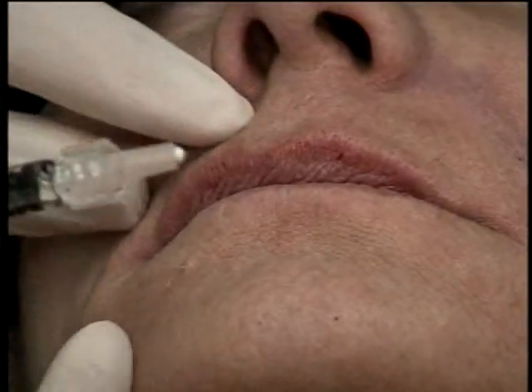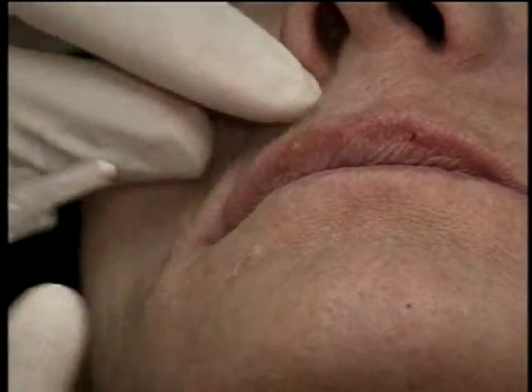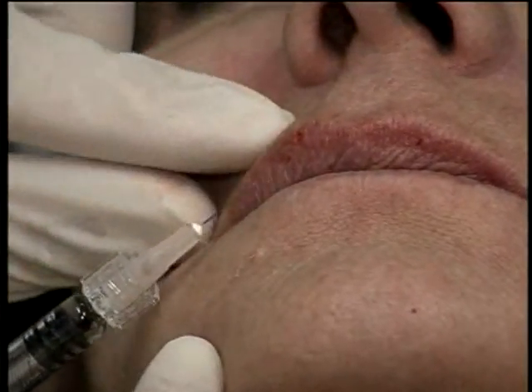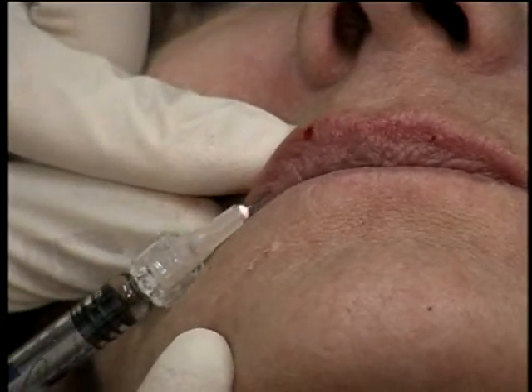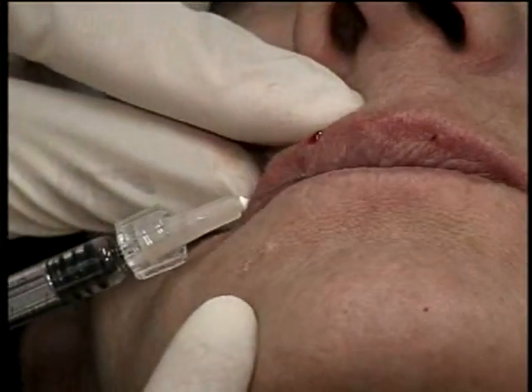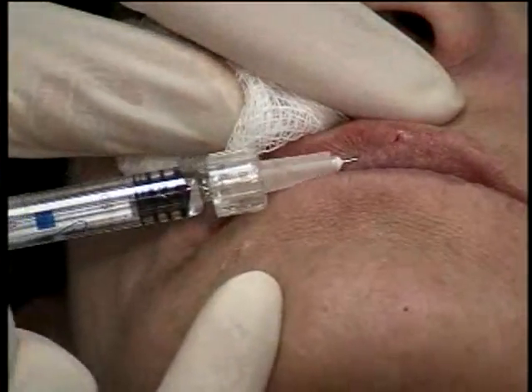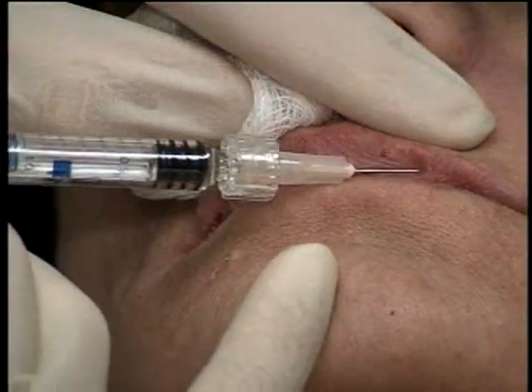And to me, it feels like I maybe could put a little more in there, so I'm going to come back here and put just a drop in that region. And that looks pretty good to me. Now if I want to try to rotate the lip out a little bit more, I may roll the lip up like this a little bit and put just a little bit into the lip body here, but I'm a little bit deeper here. And I go right along the lip body like this. And this will rotate the lip out.